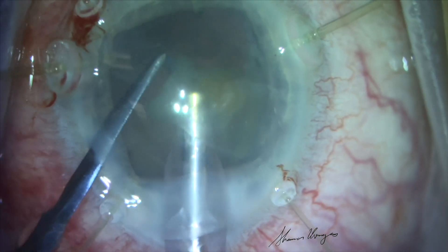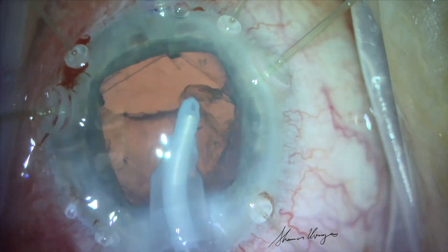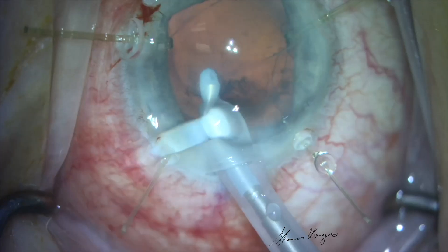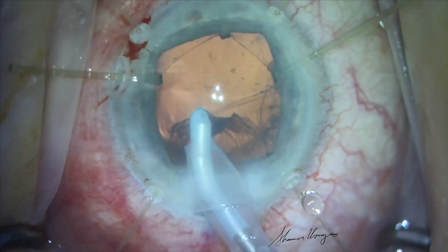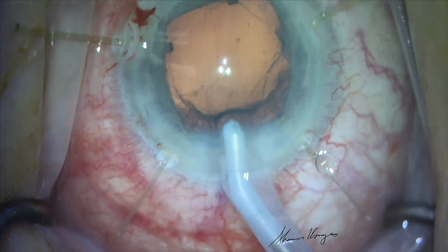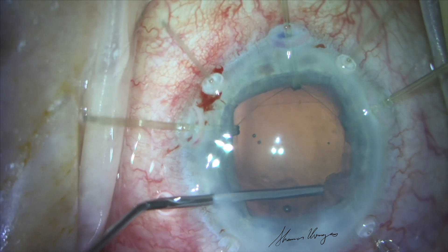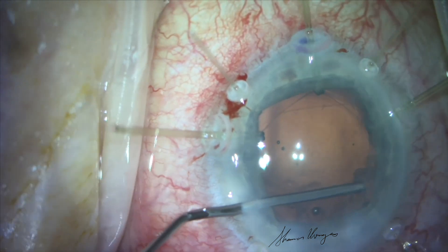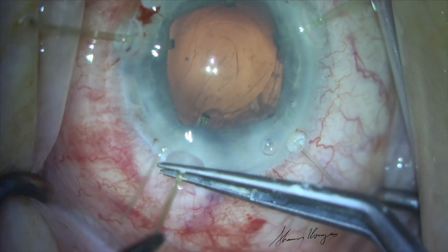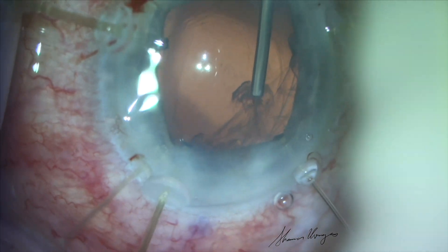Ultimately, we are successfully able to remove the nucleus. Most of the cortex is removed by irrigation and aspiration. The subincisional cortex is difficult to remove with the relatively unstable capsular bag. So viscoelastic is used to fill the bag and the viscoelastic cannula and syringe are used to aspirate the subincisional cortex. For added safety, we place a fourth capsule retractor in the area of the subincisional cortex.